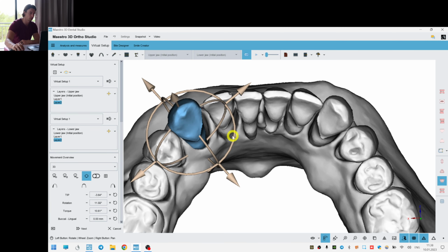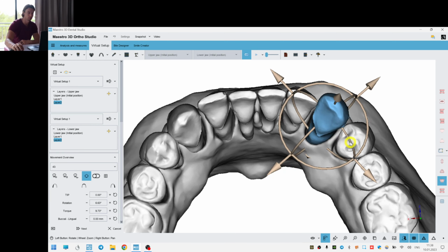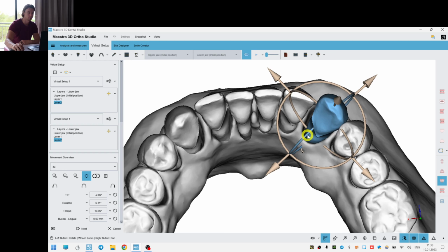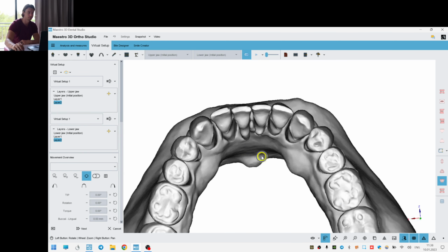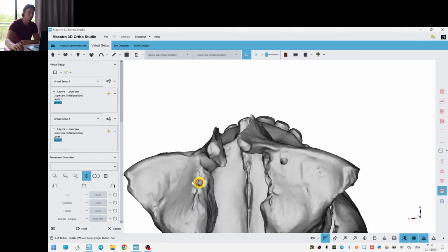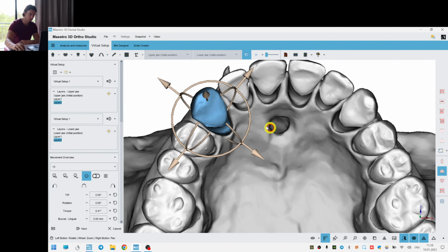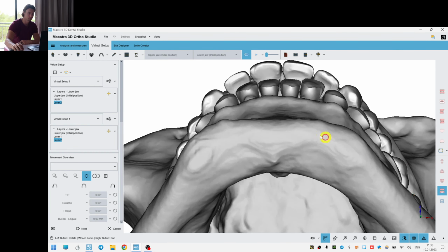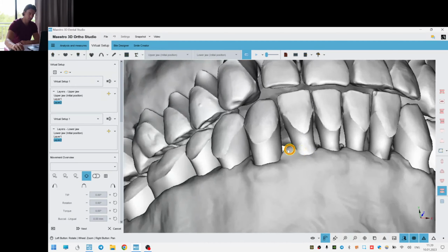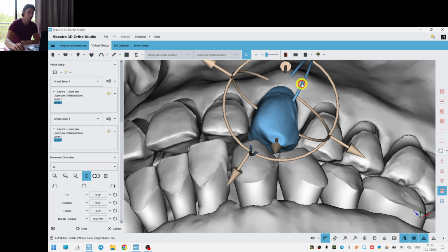And at layer 2, I'll move the canines more distally and lingually to put them more inside the dental arch. Yep, something like this. And let's get to the upper jaw and do the same. Check the contacts between the canines. I think we should make them more tight.